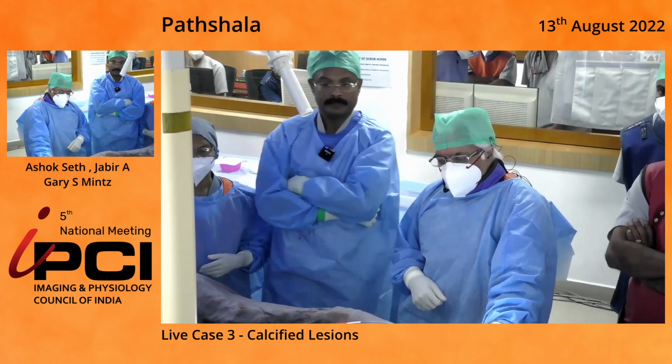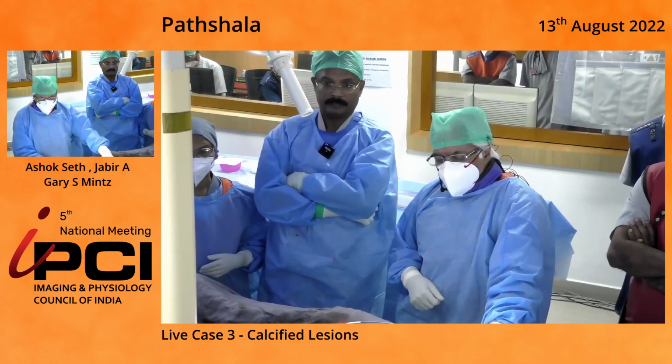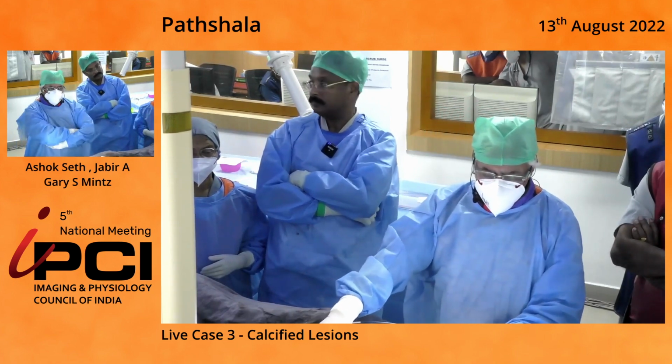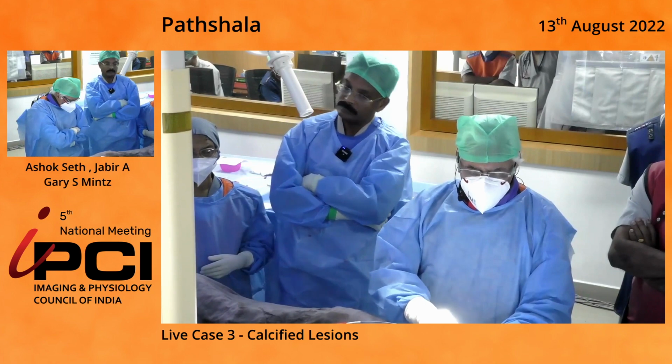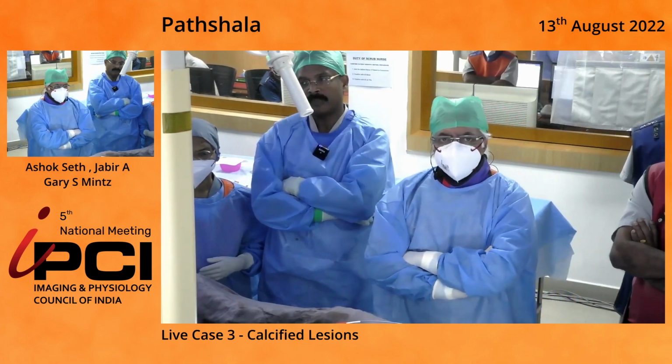Anyone else on the panel? So why don't we do this with everyone here in the audience? Why don't we raise our hands? Who says IVL should potentially be used as our first strategy here? Okay, that's 50%? Yeah, I'd say more than 50 for sure.